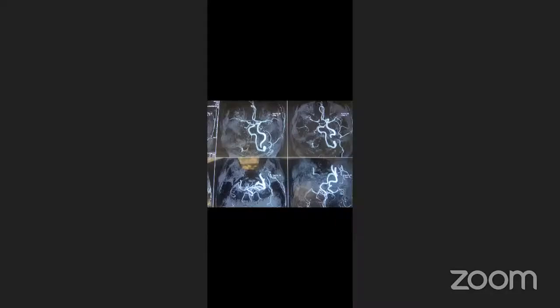In this MR angiography of the intracranial circulation, you hardly see any ICA. The left ICA is okay. You can see that the intracranial ICA is reforming, looks like from the PCA, PCOM, and then MCA. Can anybody appreciate that?